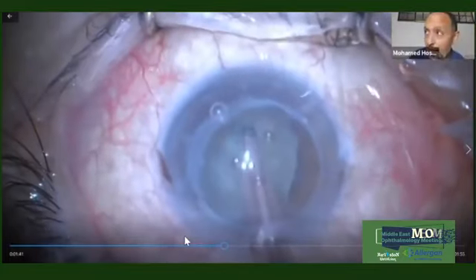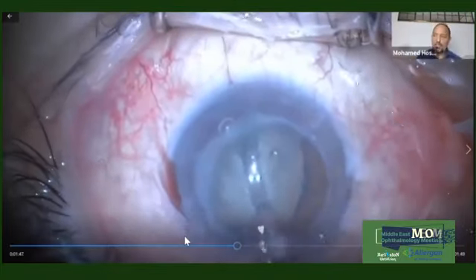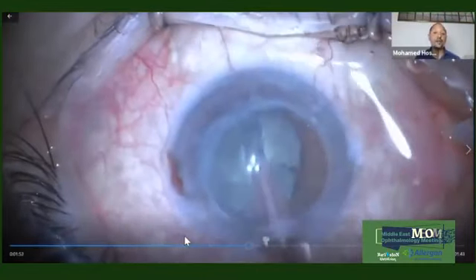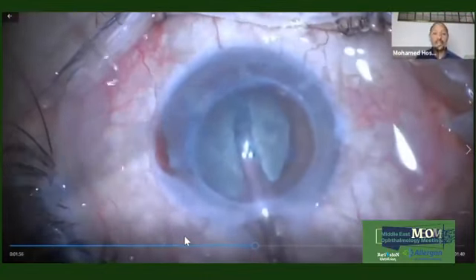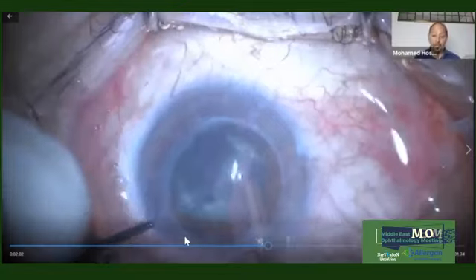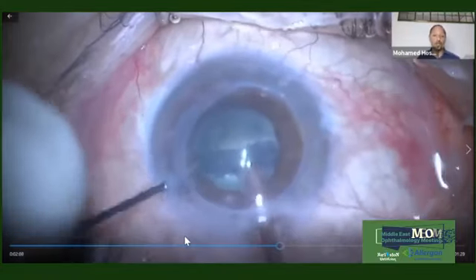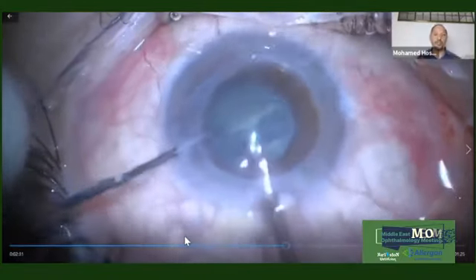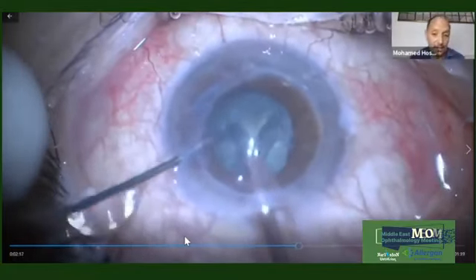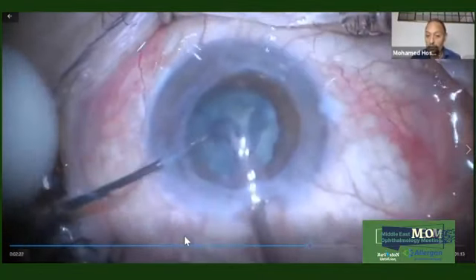I agree. But the thing is, a lot of our patients, and I mean a lot of our patients, especially in the government hospital and the university hospital I work in, come from very faraway places, and to accommodate them for one day after removing the suture is pretty much a hassle. So you actually answered one of my questions, which is, would you go for a toric IOL or not if there is a very obvious topographic astigmatism? Or would you go in these patients for a femtosecond LRI or an arcuate incision? So this is something that I wanted to ask you about, Dr. Fogler.